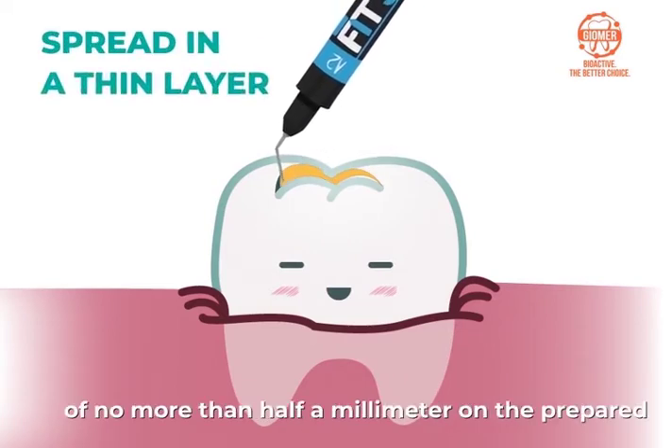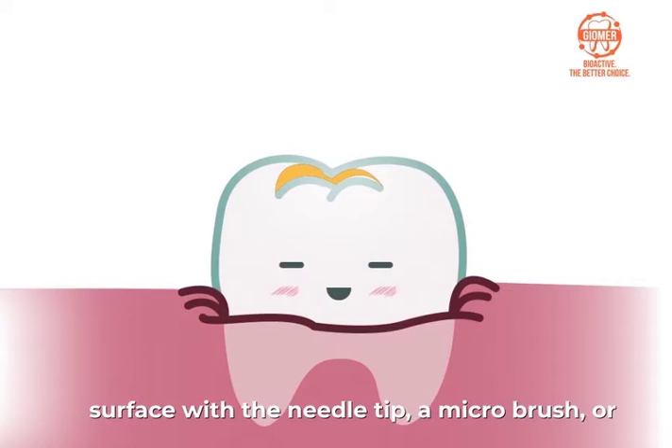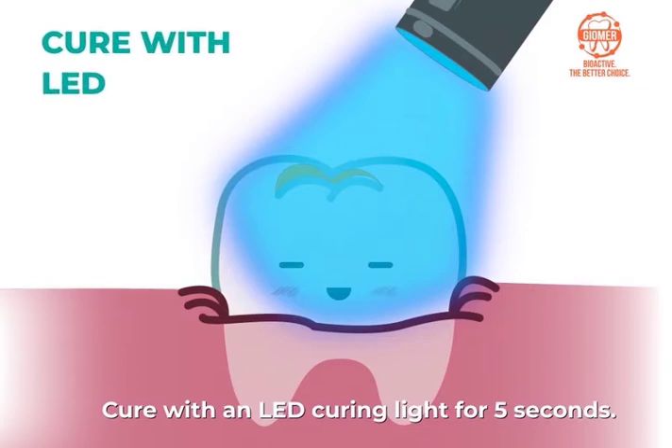Spread FitSA in a thin layer of no more than half a millimeter on the prepared surface with the needle tip, a micro brush, or forced air. Leave for 20 seconds. Cure with an LED curing light for 5 seconds.